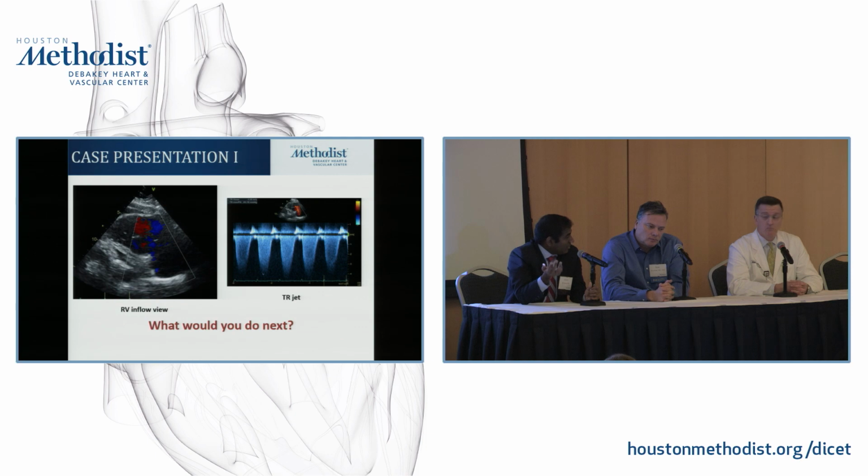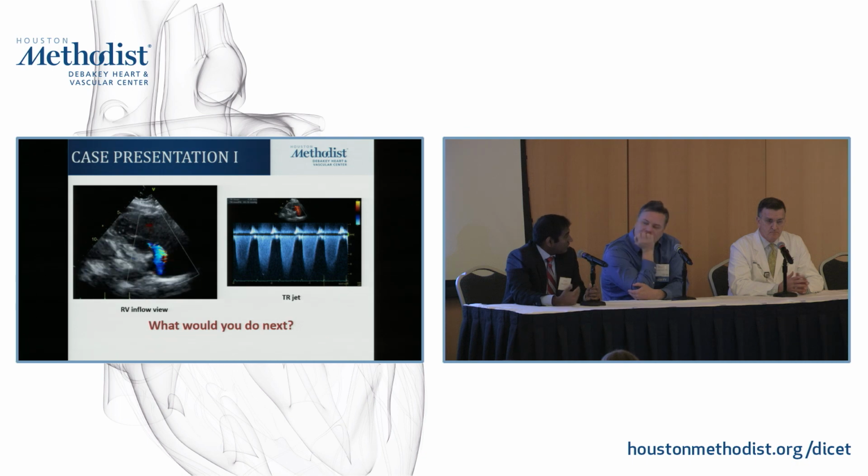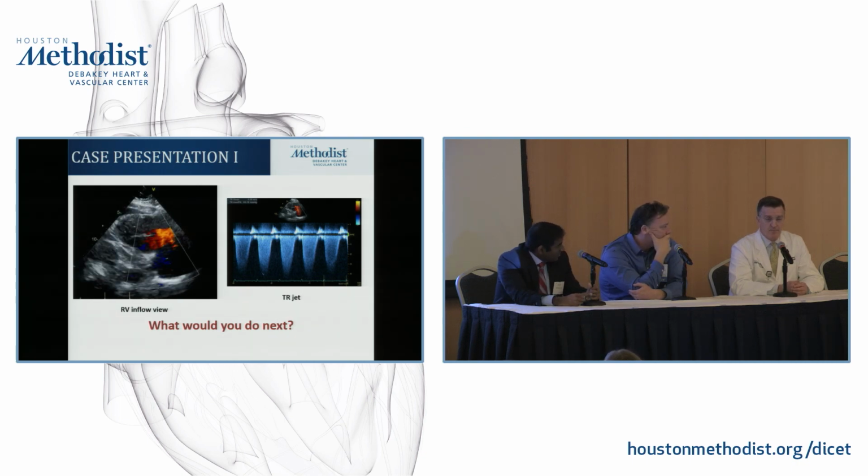Now, the right side technically shouldn't be seeing that resistance unless it's backflowing into the RV. So this is a unique situation where it's not a bad LV, they put it in for a bad RV. Physiologically, the resistance will probably backflow into the RV. But it's interesting in these situations, even if you decompress the LV, I wonder how much resistance will pass on to the RV. Well, unlike cardiopulmonary bypass that we use to do heart surgery, we have a reservoir. We can actually drain the blood out of the right side of the circulation into a reservoir. So if you look at the right atrium and the right ventricle on full cardiopulmonary bypass, it gets sucked down like a raisin. That does not happen with ECMO. The blood just keeps circulating around it.